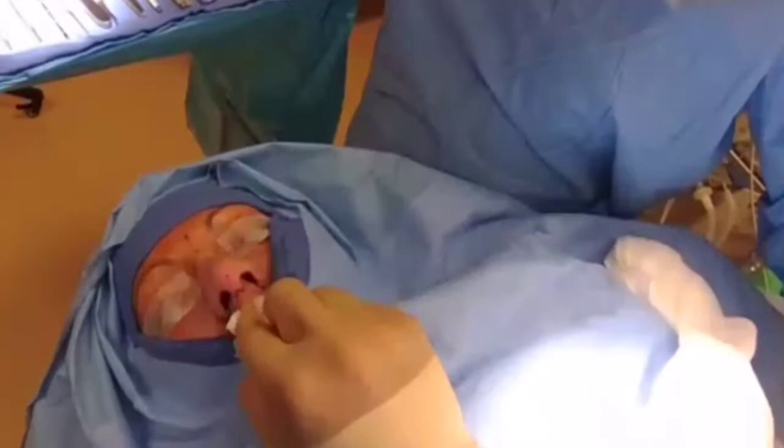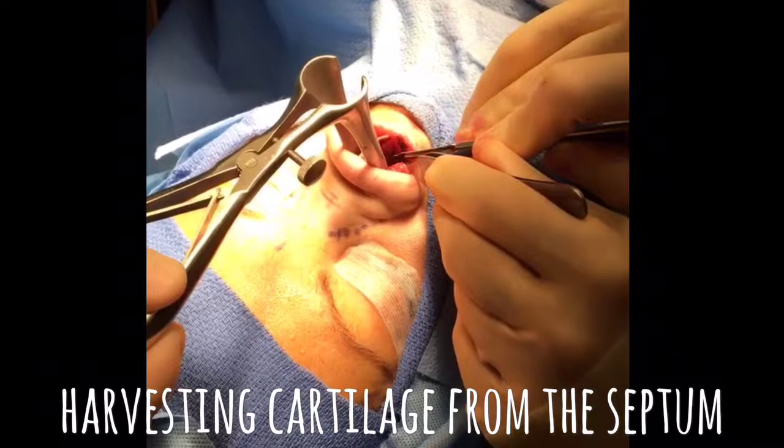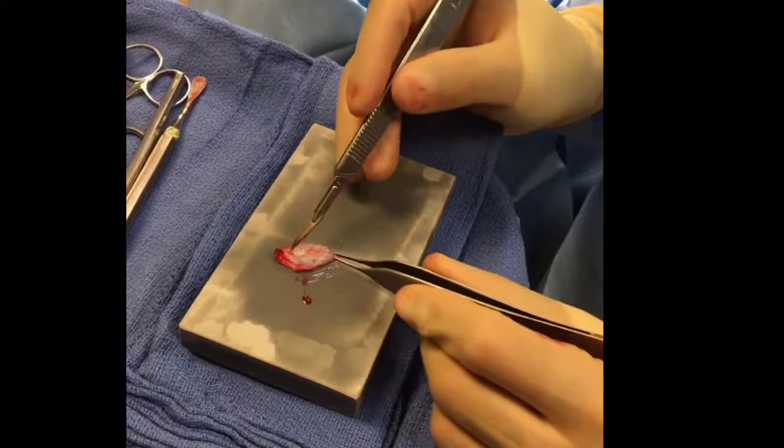We've reduced part of our cartilage. This is the cartilage that we're going to keep, and this is the cartilage that we're going to harvest to rebuild some of our nose. This is our septal cartilage, and we're going to make three or four strips out of it to rebuild the nostrils and the bridge.